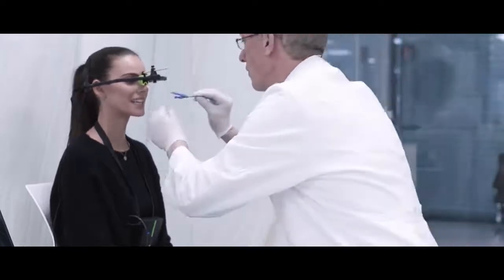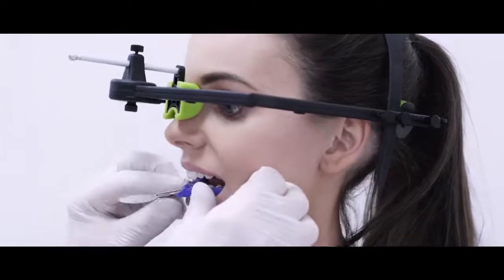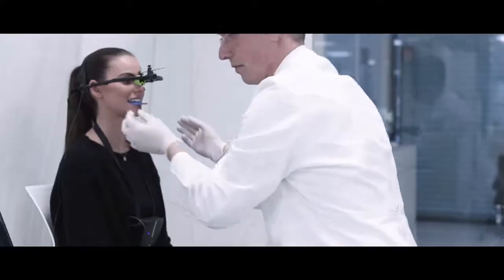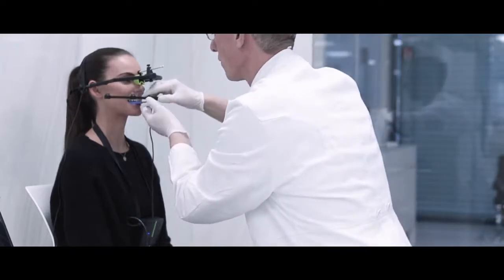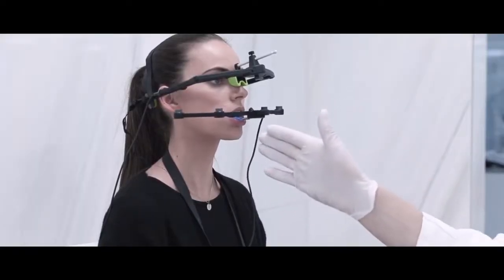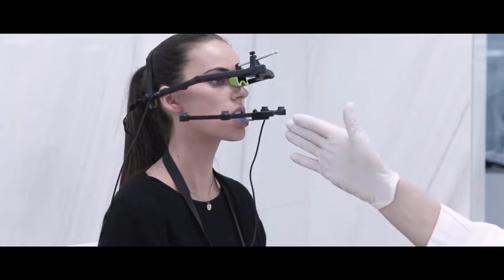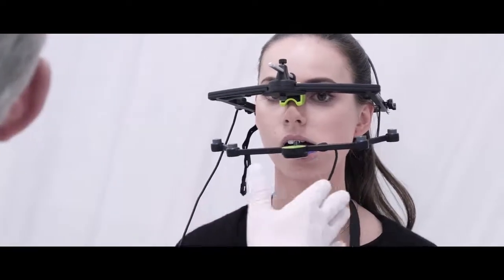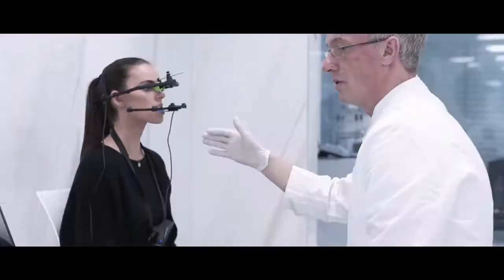The doctor places the fork on the mandibular arch and attaches the lower arch of the plane analyzer. The patient is asked to repeat with her jaw the movements shown by the doctor, in order to digitize them, such as mouth opening movements, protrusion, and left-right lateral movements. The plane analyzer creates a PDF document with the indications of the parameters needed to individualize the articulator.